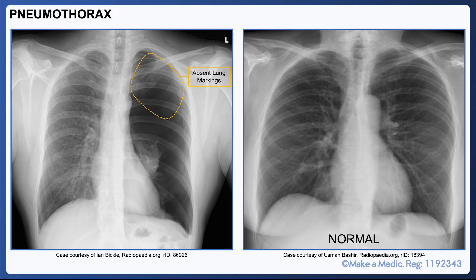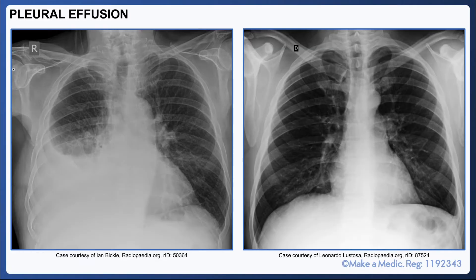You should not normally be able to see the pleural edge as it is closely tethered to the chest wall. However, in this case you can see a very clear pleural edge. Compare this to the normal chest X-ray on the right, where you can see lung markings throughout both lung fields.